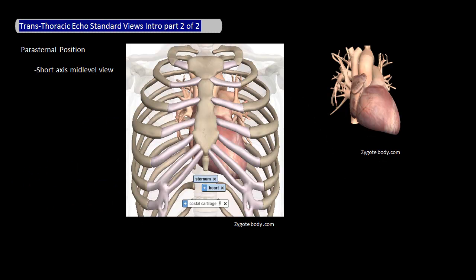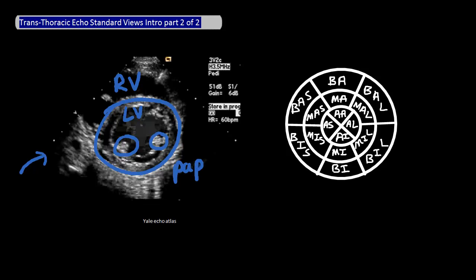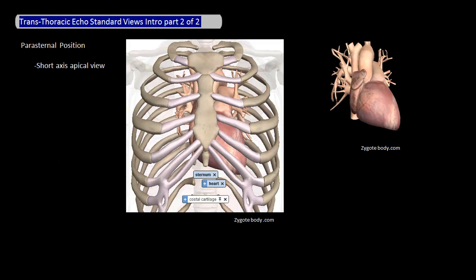The fourth view is the short axis mid-level view at the parasternal position. This view is pretty much the same as the previous one, except that you're looking mainly at the mid-level of the left ventricle instead of the basal level. In a real echo, again from the parasternal position, the right ventricle is up top, and the left ventricle is here. Since this is at the middle of the left ventricle, you'll also be able to see papillary muscles instead of the mitral valve. You're looking at these six mid-level parts of the left ventricle.